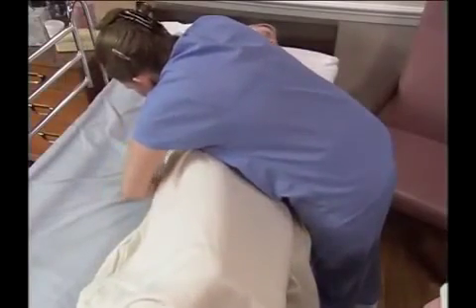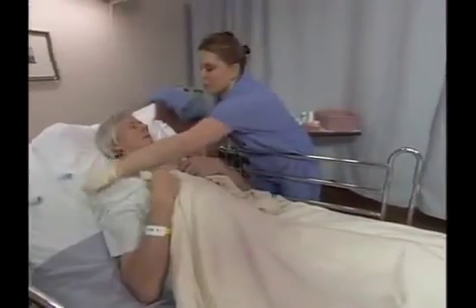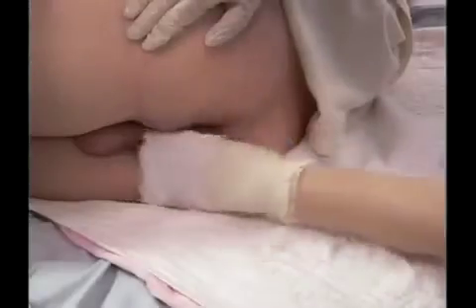Check the person's skin and garments frequently. Remove soiled garments promptly, and provide perineal care. For men, a condom catheter is sometimes used. This external device is applied to the penis and connected to a drainage bag to allow urine to flow away from the skin. Here again, meticulous skin care is very important to ensure that no breakdown occurs.